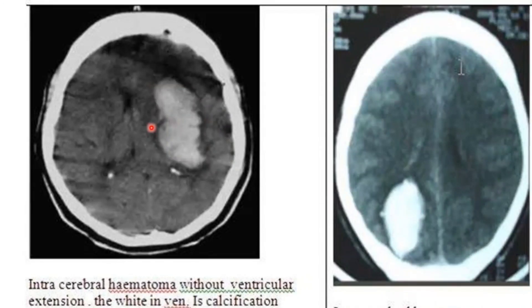To differentiate hemorrhage from calcification: hemorrhage always has mass effect, while calcification does not. Here you can see choroid plexus calcification for comparison. Calcification has a greater density than blood. On the next image you can appreciate an intraparenchymal hematoma in the posterior aspect of the parietal lobe.